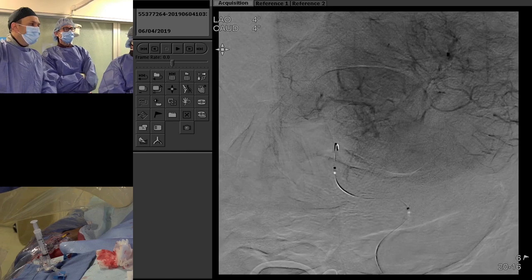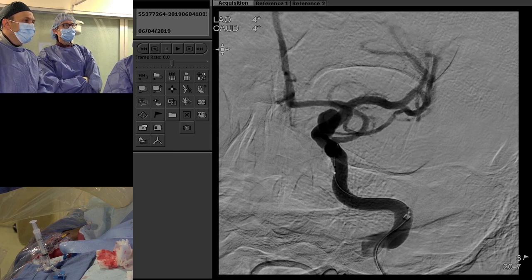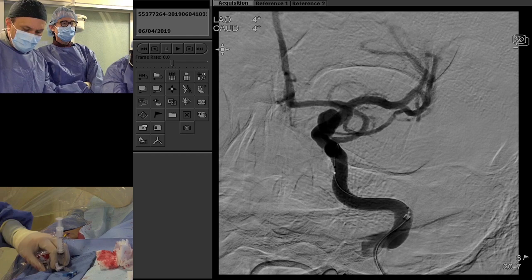For these kind of aneurysms that are slightly larger and wide-necked, occasionally we'll put some coils in the aneurysm to try and promote early thrombosis of the aneurysm, so that's what we're going to do today.